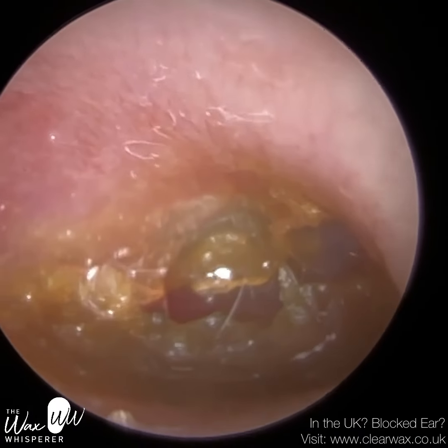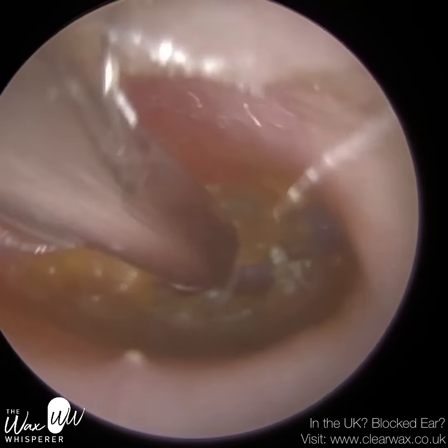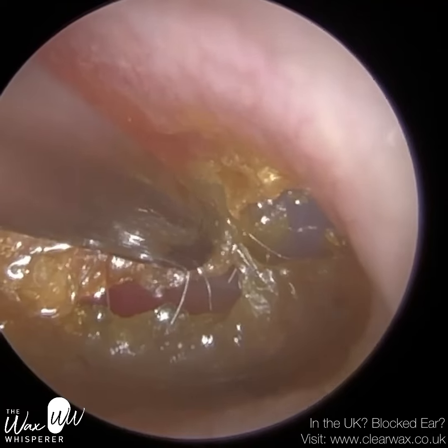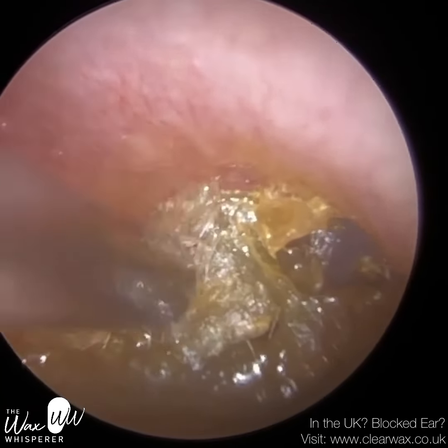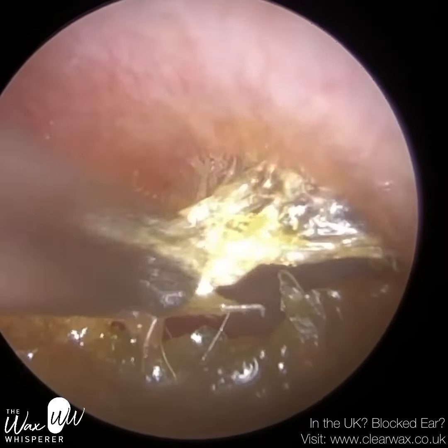This skin is too deep in to use any of the instrumentation. You can't use a hook or scoop because you'll obviously hit the eardrum. You can't use forceps because there's nothing to grab onto. So I'm going to have to rely on suction here. And this is what this oil has done — it's just softened this dead keratin just enough.